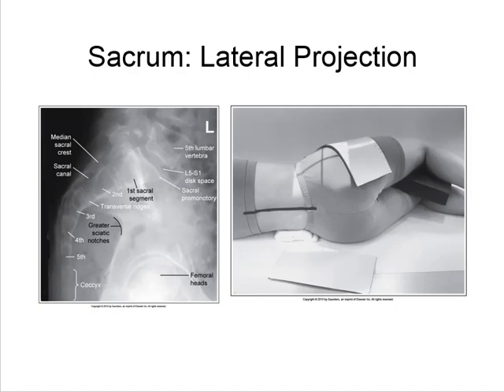What you can really do there is find the peak of the iliac crest and go just posterior to it, and that should get you there as well. So the top of the iliac crest would be right around in here. Put your longitudinal line there and then move the patient forward a little bit, but keep the center of the image at the level of the ASIS.